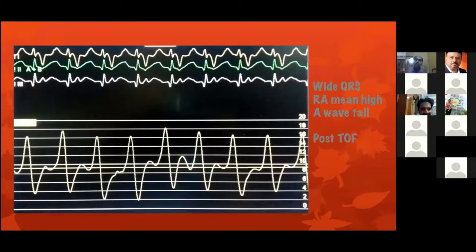So now the cumulative stroke volume is what the left ventricle should normally eject plus the regurgitant volume. So a high stroke volume. High stroke volume means high left ventricular systolic pressure and high aortic pressure. In the same way, high RV systolic pressure and high PA systolic pressure.